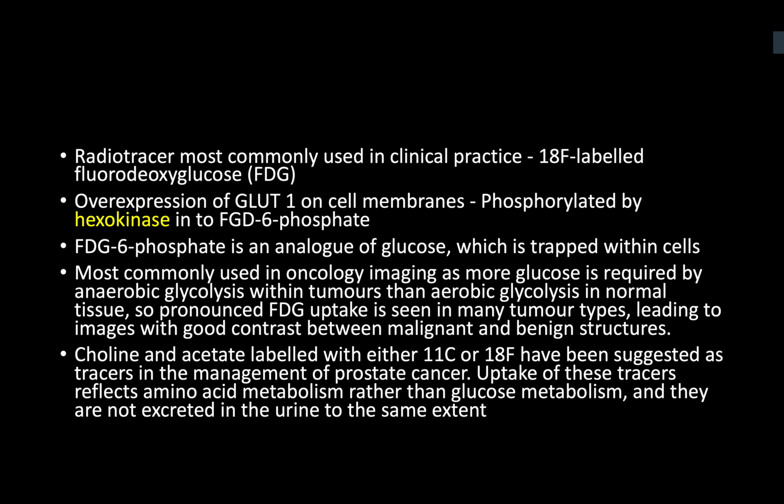Okay. Coming to the PET scan, which is coming more in favor in the prostate cancer scenario. What is the most common radio tracer used in clinical practice for PET scan? So it's choline. Okay, so is it choline PET? Yeah, choline PET is also falling out of favor, I will come to that. So the most common in the whole oncology scenario is FDG.